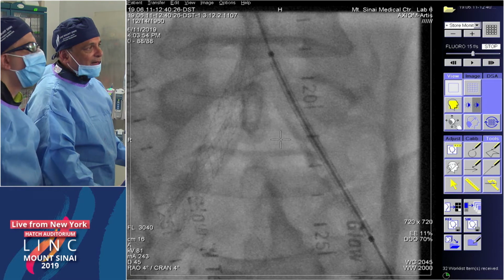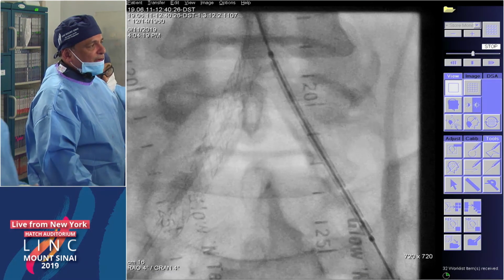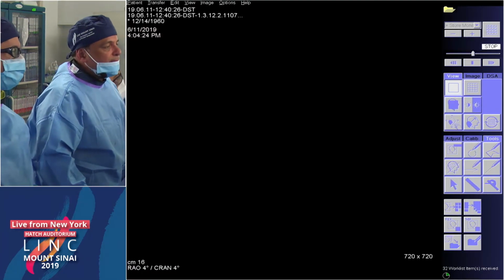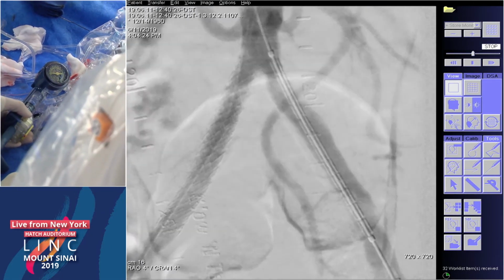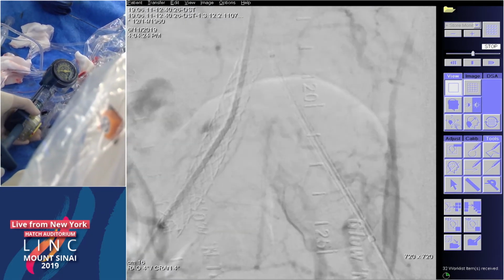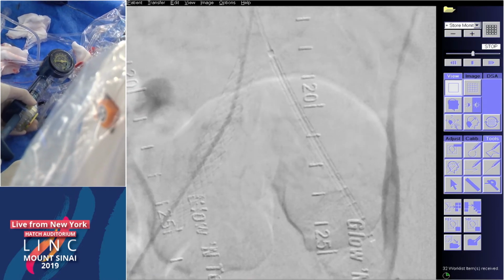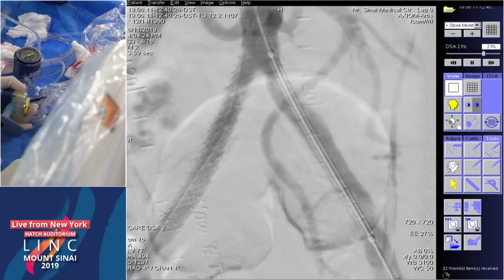So isolated, even with covered stents, do you just go ahead and do aspirin, or do you look at the runoff before you do it? I think if it's isolated common iliac disease and you have covered stents, I would just do aspirin. We do aortobifemoral bypasses all the time. We don't keep them on anything but aspirin, and it's actually very good. There's such high flow and they're large caliber. You're doing 8 mm VBXs, large caliber, high flow.